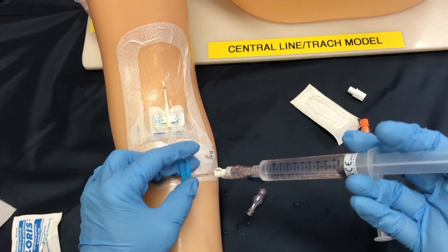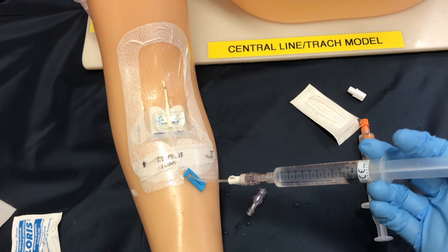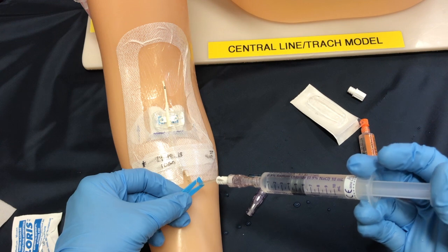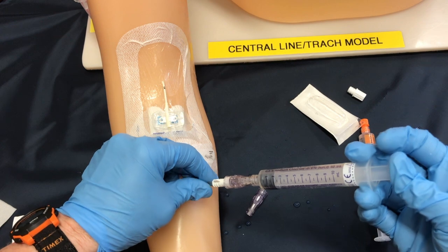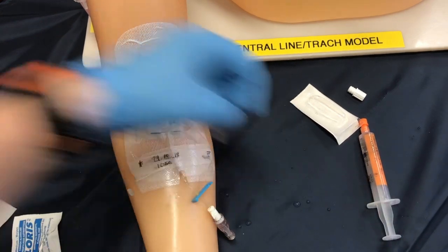Now I can go ahead and instill this 10 cc's after unlocking my line. I do not need to look for blood flashback because I've already checked patency prior to my med admin. Simply administer using a pulsating pressure and lock off your cap in the last mil of fluid infusion. After detaching the saline syringe, you are now left with the new cap.